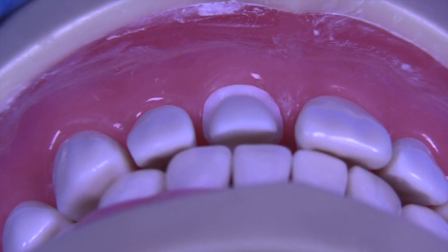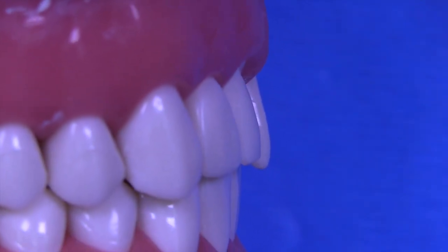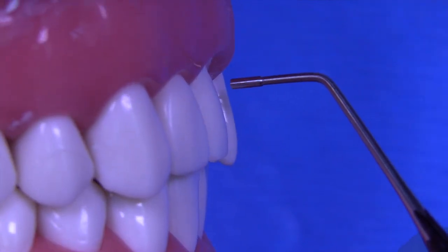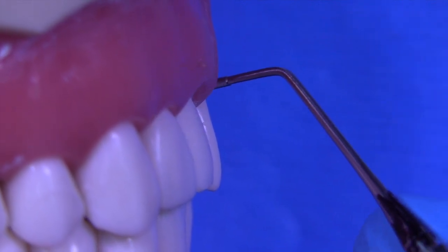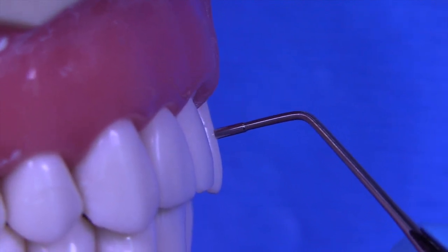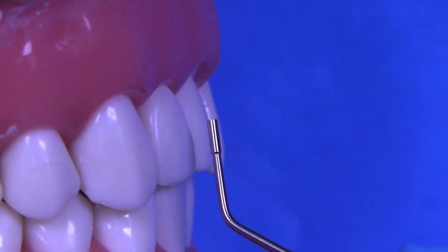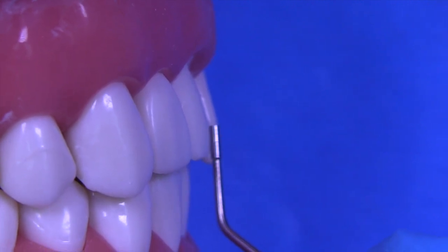Let's take a look at our third view. The third view is the side view, or you could refer to this as the silhouette view. This is a view that tells us very much about the way you reduced your facial. And so what we do with this view is we line up the facial area here on one tooth, and we line it up with the facial of the other tooth, okay? And so what we're doing is we're looking for, is this reduction getting gradually more as it goes down towards the incisal? In this area, it should be 1.0, maybe 1.2, but then it should be about 1.25, 1.3, and here at the end, it should be 1.5.